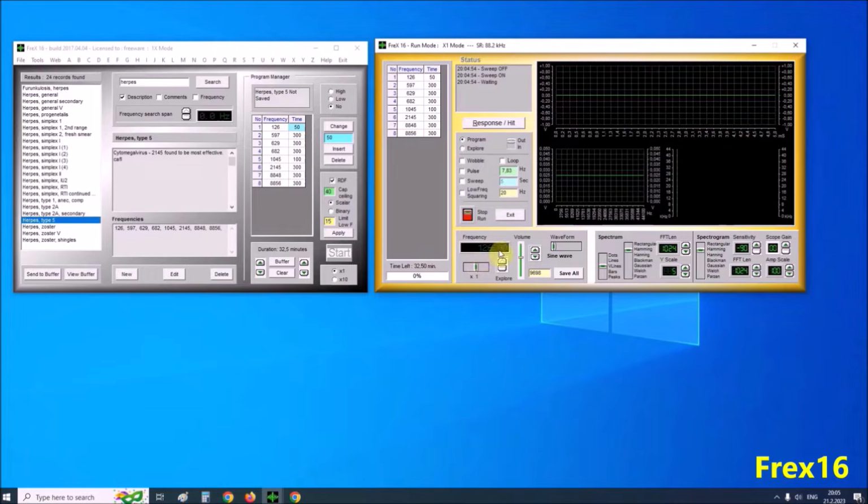This is the start frequency, the volume slider, and the shape of the output signal. We can choose different shapes of the signal: sine wave, next square wave, triangle wave, sawtooth positive, sawtooth negative. It has also a white noise generator. In practice, rectangular and sawtooth negative shapes are mostly used. In this section is visually presented the shape of the signal that is currently being generated. The program starts when you click on the run button.